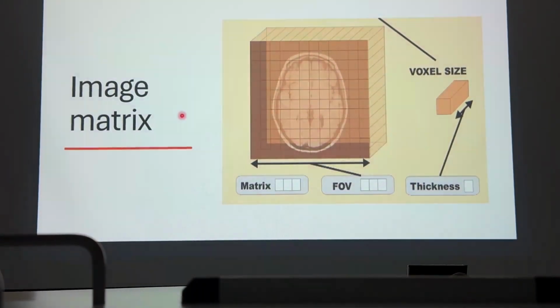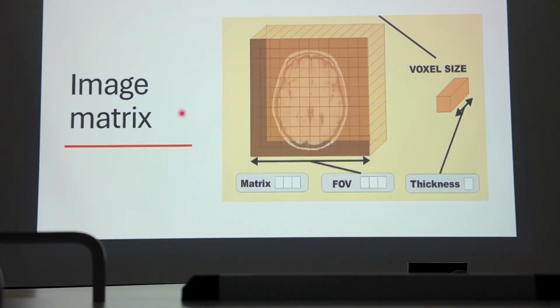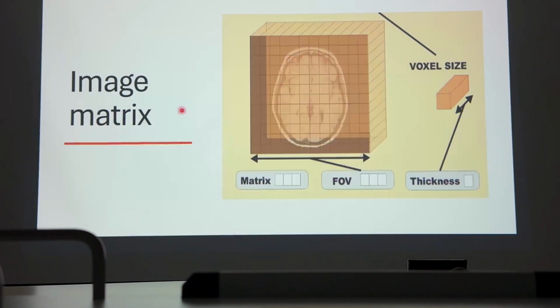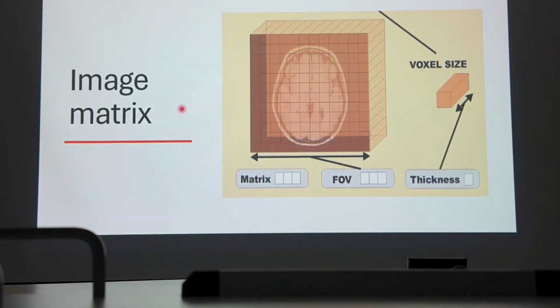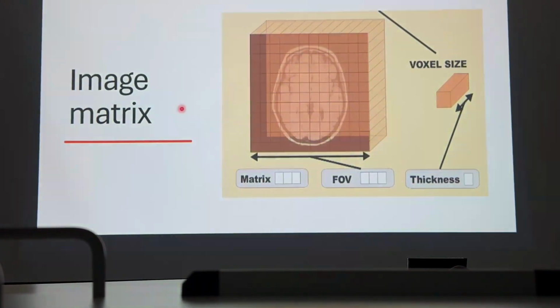This leads us to a question: is noise an artifact or not? By definition, noise is most likely not an artifact. Why? It is always present, it is rhythmic, it is continuous, but artifacts are usually irregular, irrhythmic, and partial, and not always present.